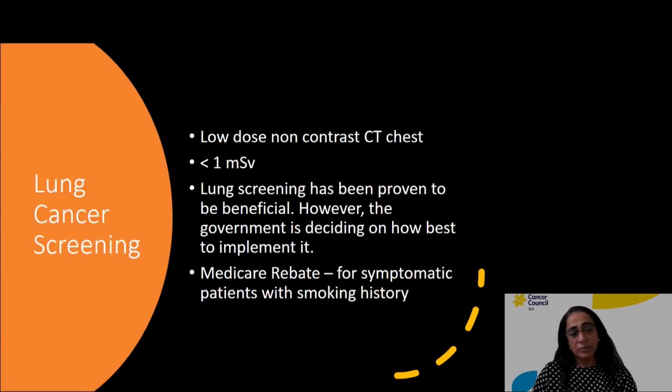And now, the role of CT in lung cancer screening. Studies have shown that CT scanning for lung cancer screening is beneficial, but the Australian government is deciding on how best to implement this in our population. Lung cancer screening CTs are low-dose non-contrast CT tests, and they involve less than 1 millisievert of radiation dose. The current Medicare rebate is for symptomatic patients with smoking history.